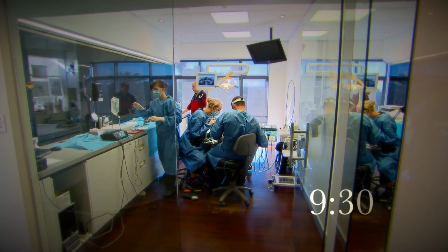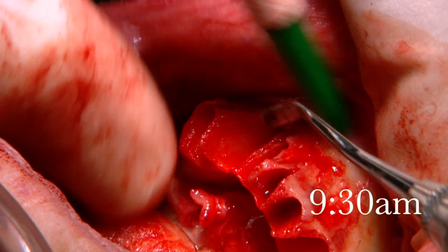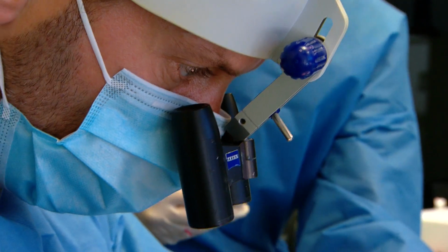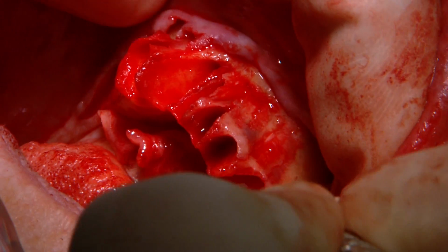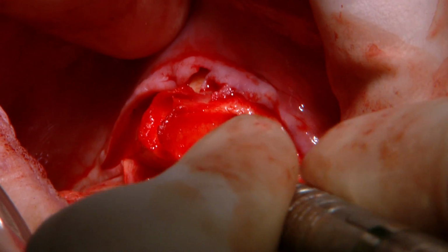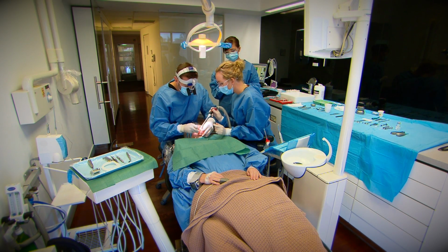The next stage of a lower all-on-4 is what we term the alveolectomy. And what that means, the alveolar process, is the bone that holds in the teeth. And this bone, I guess, is a bit like honeycomb. And one of the issues is you can see how thin it is here, how bits are missing around teeth. This particular bone is removed.